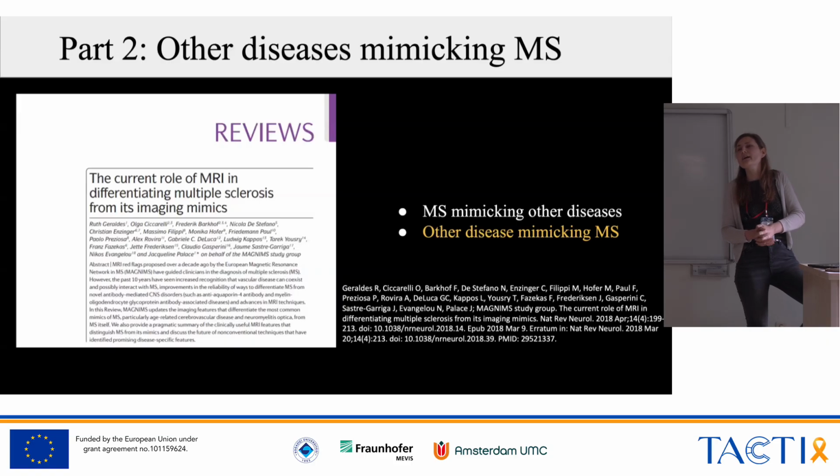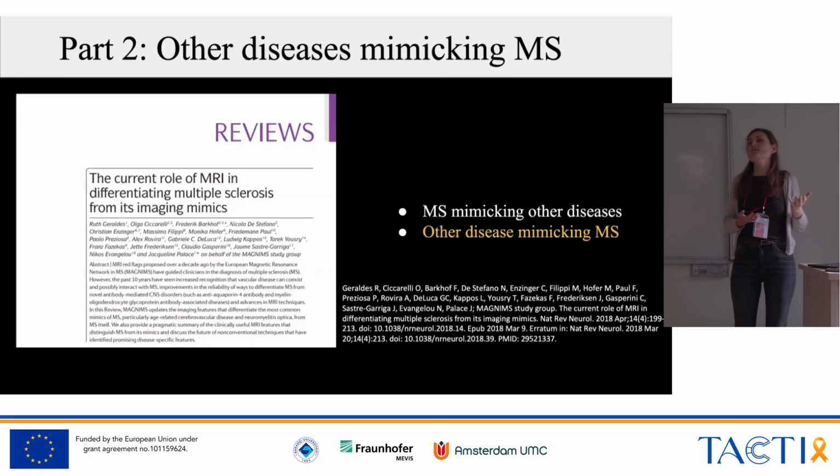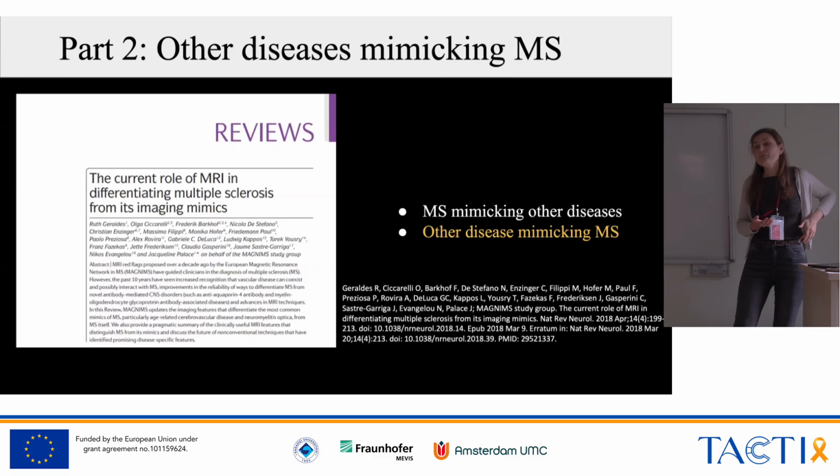There was a question in the very back. How about stroke? Strokes, I will show you cases. The classic strokes where a proximal vessel closes produce larger lesions. Those could still be, I don't know, a Marburg variant of MS where you have giant lesions, but at least it doesn't mimic the small lesions that you see in Charcot-type MS. Also, stroke usually has a clear evolution, especially when a larger vessel closes, because you'll see a persistent deficit.